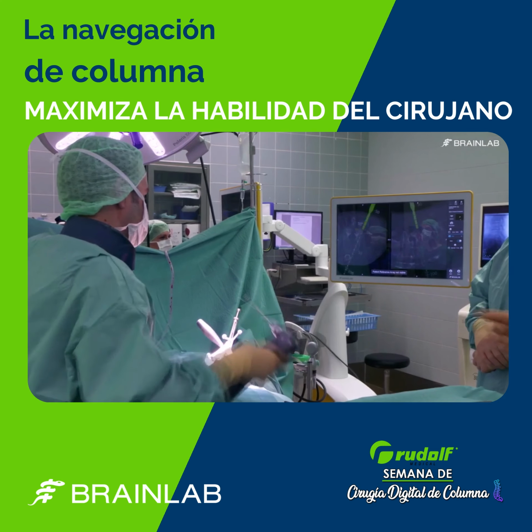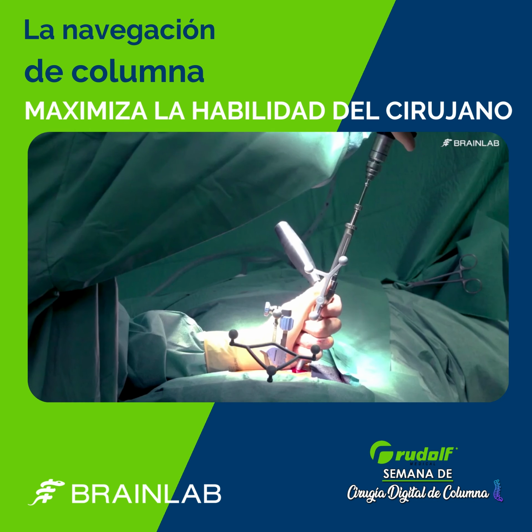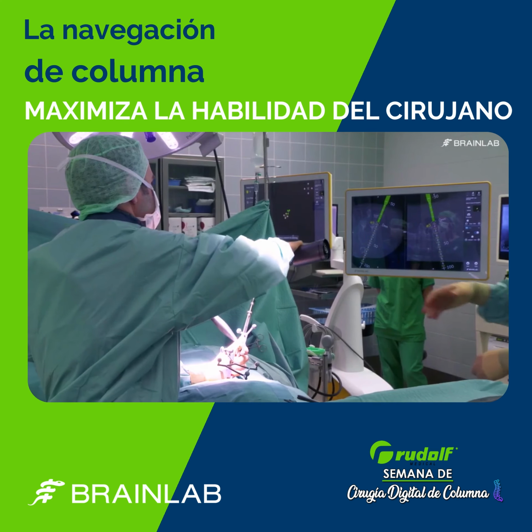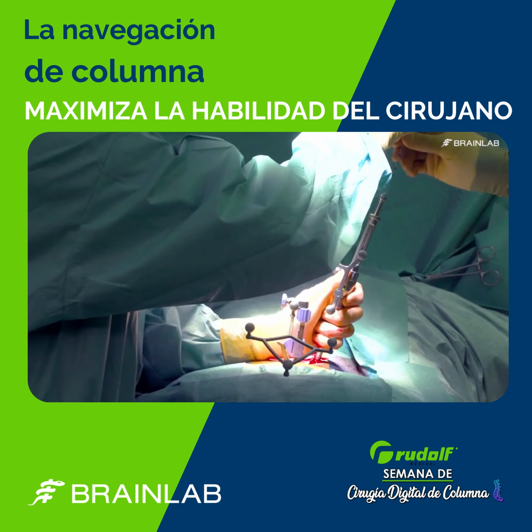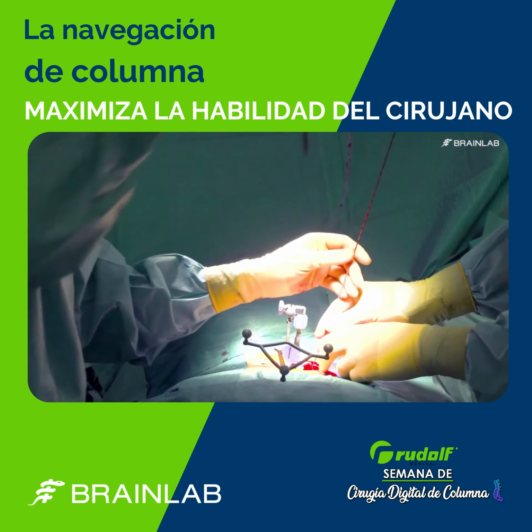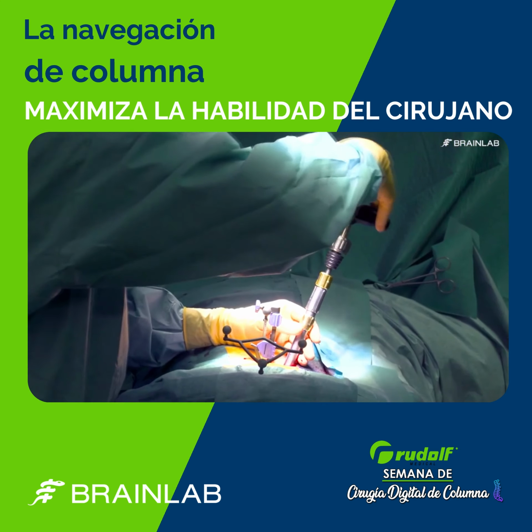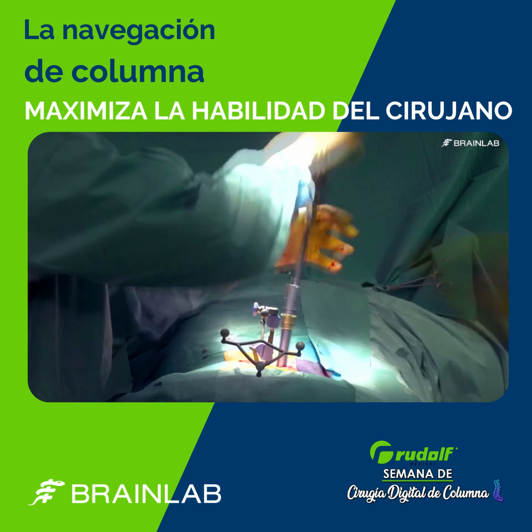Once the optimal trajectory is determined, a drill is inserted through the guide to drill the pilot hole. The depth control can be adjusted to precisely define the maximal depth. The drill is removed and a K-wire is inserted through the drill guide. The drill guide is removed and the first cannulated screw is inserted over the K-wire and guided towards the pilot hole. After the screw is firmly in place, the K-wire can be removed. These steps are repeated for the remaining screws.